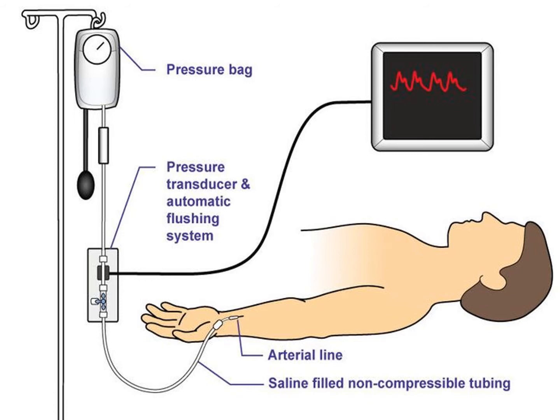We might actually think their blood pressure is good, and it's not, because we did not make sure the transducer and their heart were level with each other. So that's something important that we'll have to do. Usually we re-zero the A-lines when we're leaving the ICU room to take this person on a transport to the OR, to the IR, to CT scan or MR, you name it.